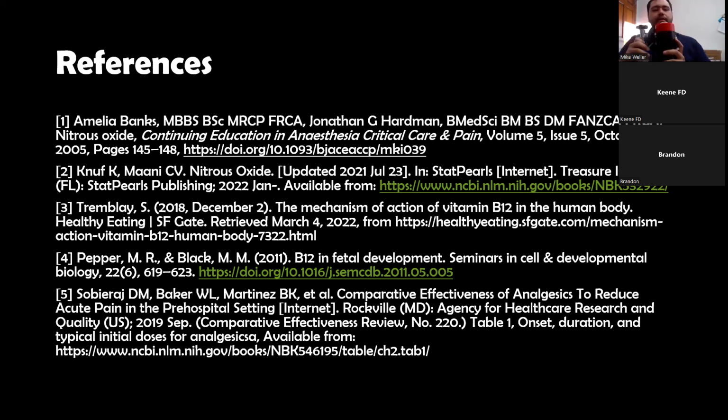The mixing chamber has a little pressure gauge on the top of it, and then you've got this little red cap here. That's where the tubing to the mouthpiece is going to go. The oxygen connects over here. You can actually take this oxygen hosing off if you would like to. Oh, no, you can't. I lied. And then you've got your hose to the administration set. So this just pushes right on down. It's going to click into place on top of the mixing chamber.